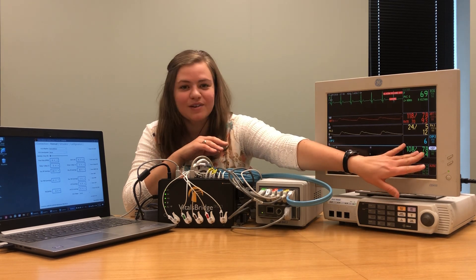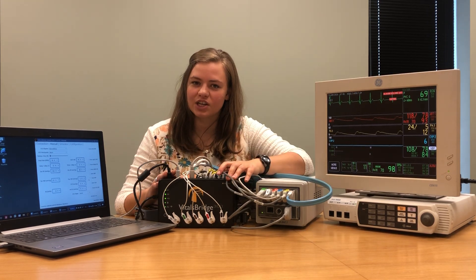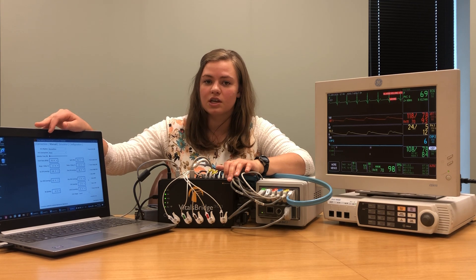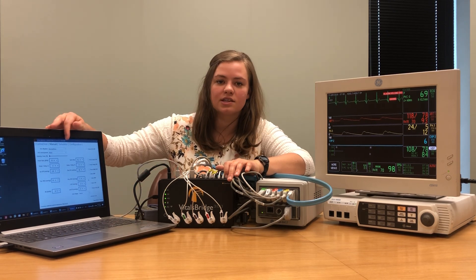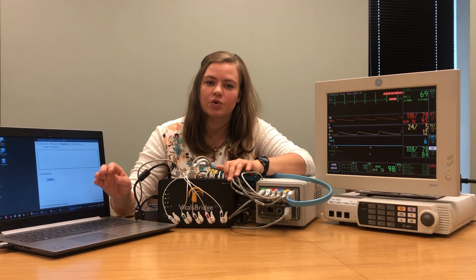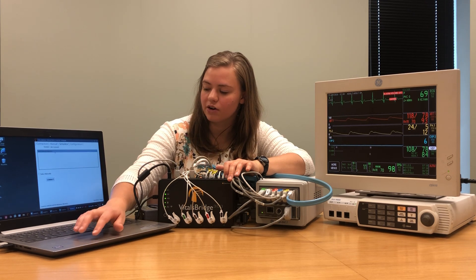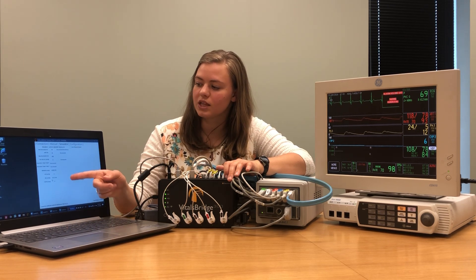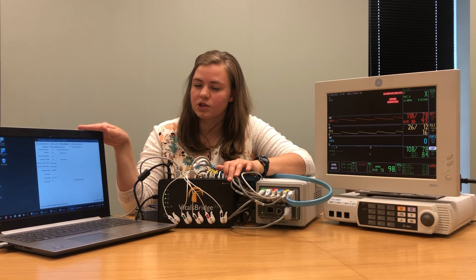You'll see we've got a wonderful reading for non-invasive blood pressure, so we know that everything is working well with our patient monitor and VitalsBridge connections. You can continue to control the VitalsBridge using the connector software in the manual tab, or you can use any Laerdal simulator to control your VitalsBridge. To connect to a simulator, come to the simulator tab in your VitalsBridge connector software. Any simulator you currently have running will show up on this screen — I have a virtual simulator running on my laptop. Select the simulator and press connect.